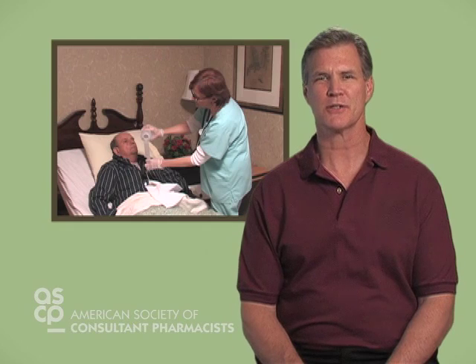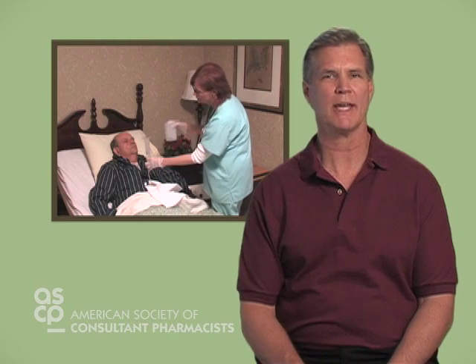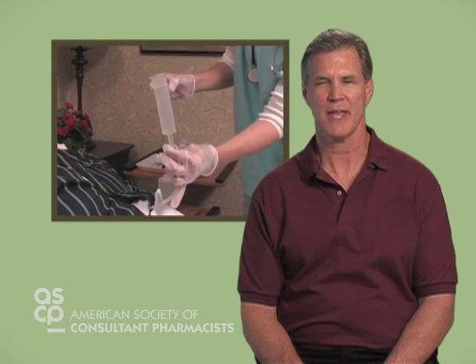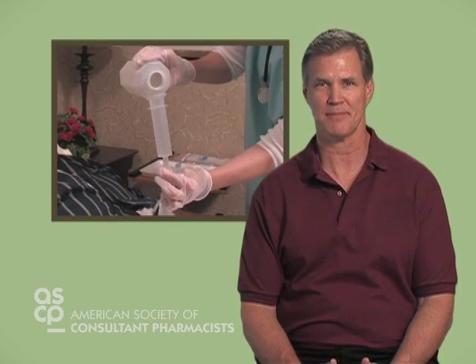A G-tube is a tube that is placed directly into the stomach by a small surgical opening through the abdominal wall. A person experiencing impaired swallowing and a need for long-term nutritional support will have the option of G-tube placement. There are numerous diagnoses that can preclude the election of a G-tube placement, but regardless of the reason, the procedure for medication administration by way of a G-tube is the same.